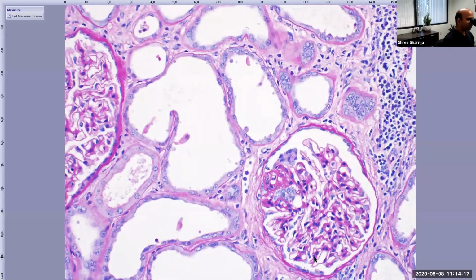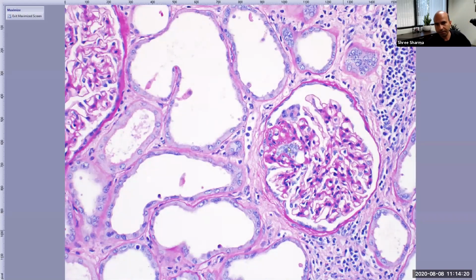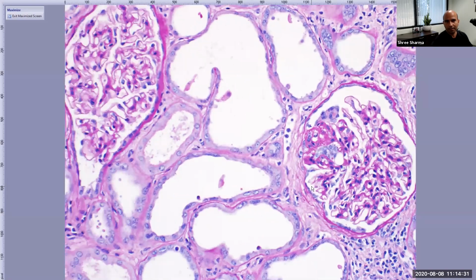Matt, you pointed out the morphology of this lesion. So the constituents of that lesion are important, the matrix and the cells. The other thing which will be important subsequently is the location. Where is that lesion present?